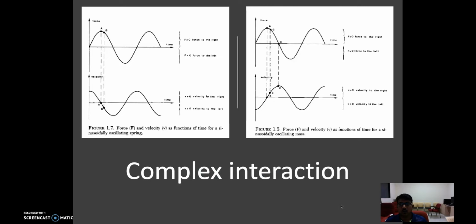Okay, so what do these three components do? As I said, the reactance mainly reacts to the input sound. The input force is a sine wave, as you know, and like how impedance in a steady force is loss of some energy, so similarly here in a dynamic force, you tend to lose some amount of energy, mainly in terms of phase shift and also in amplitude reduction.